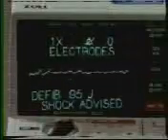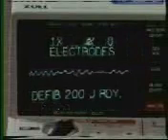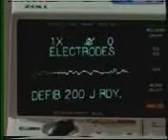The operator now pushes the charge button, which is labeled number 2. After 6 to 10 seconds of charging, a charge-ready continuous tone will sound, and the message "defib 200 ready" will be displayed on the monitor. The operator must clearly announce, "I'm clear, you're clear, we're all clear," before pushing the discharge buttons. Then look to make sure that all present are clear.